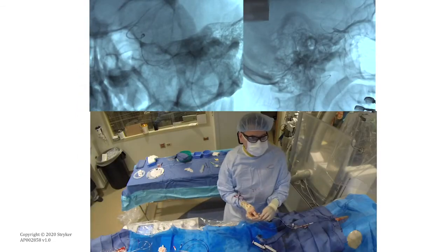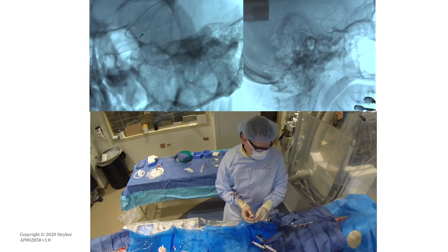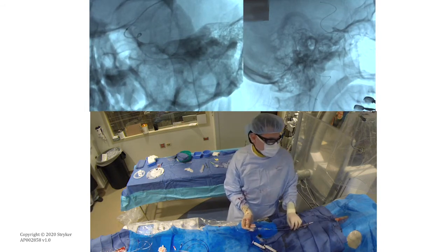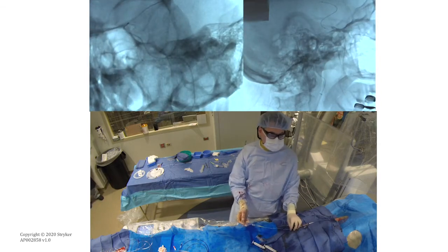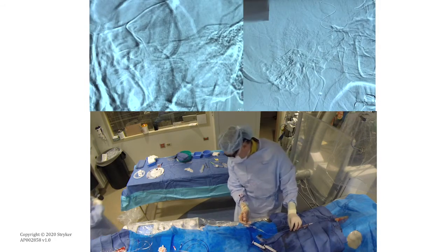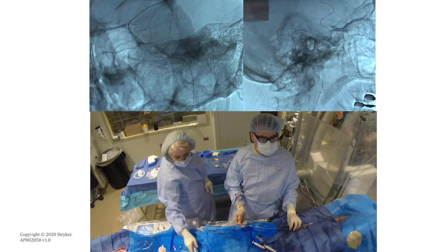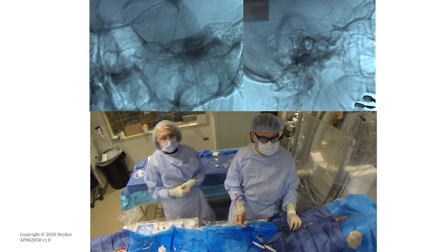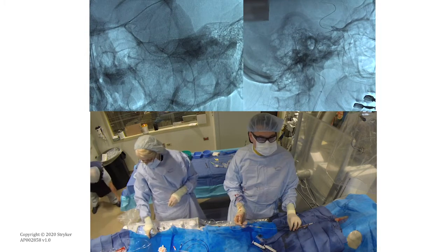So Trevo is going up despite a significant tortuosity. You see the position of the balloon guide at about the C2 level, and now you're going with the Trevo without significant movement of the patient's head. It seems to be relatively well tolerated, despite the challenge of navigating this tortuous anatomy. So now we are unsheathing the microcatheter and deploying the Trevo.